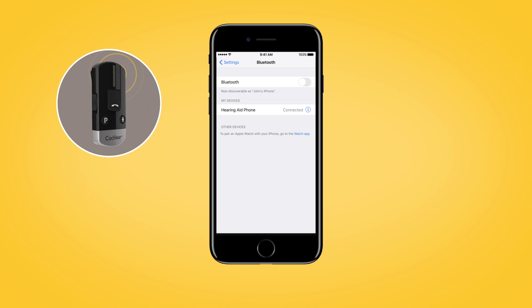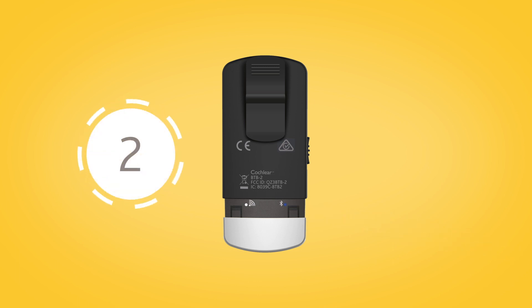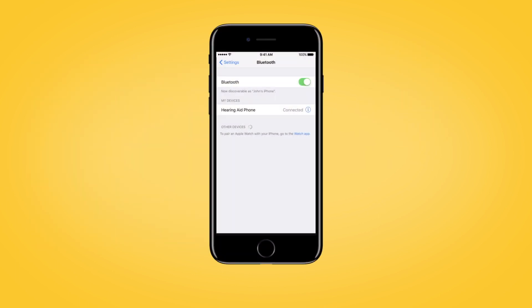To pair your phone clip to your mobile phone, make sure that your phone's Bluetooth function is switched on. Remove the silver cap and press the pairing button on the back to activate the pairing mode for two minutes. During pairing mode, the LED will turn blue. On your mobile phone, search for new Bluetooth devices and select Hearing Aid Phone from the list.